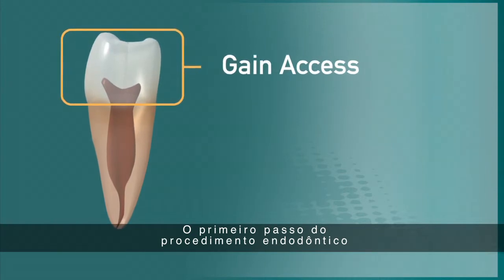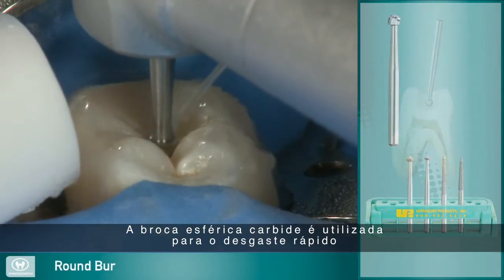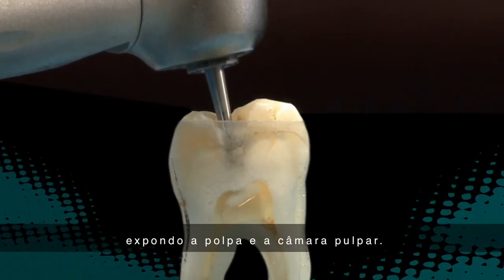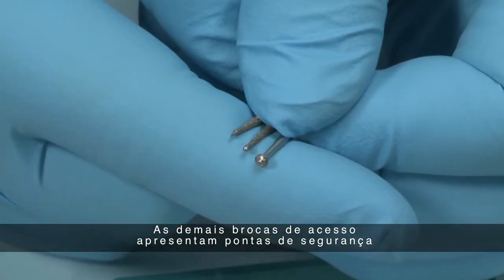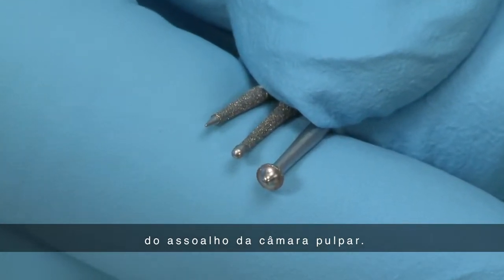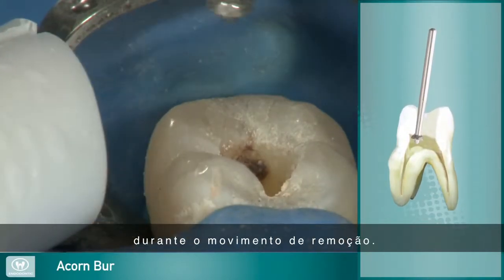Step one in the endodontic procedure is to gain access to the pulp chamber. The round carbide burr is used to quickly cut through the occlusal table of the tooth, exposing the pulp and pulp chamber. The remaining access burrs feature safe-ended tips to minimize the risk of pulpal floor canal perforation or other damage. The acorn burrs, available in two sizes, are designed to remove dentin and enamel on the upstroke.